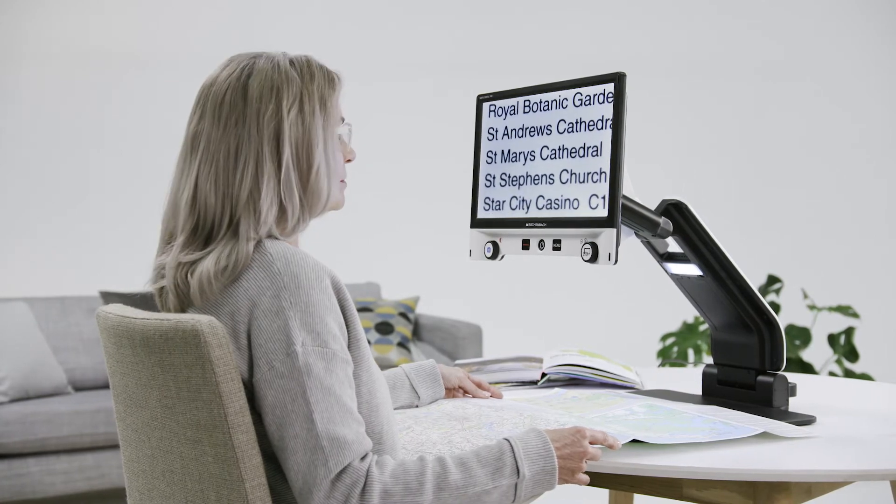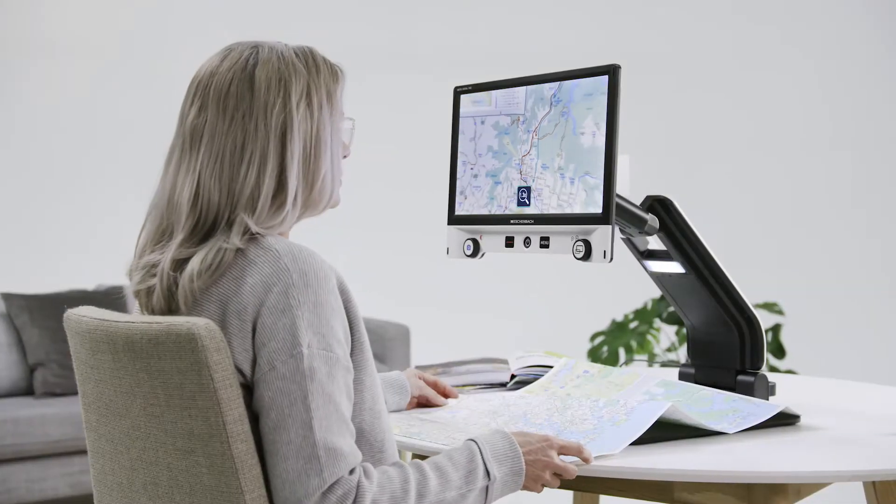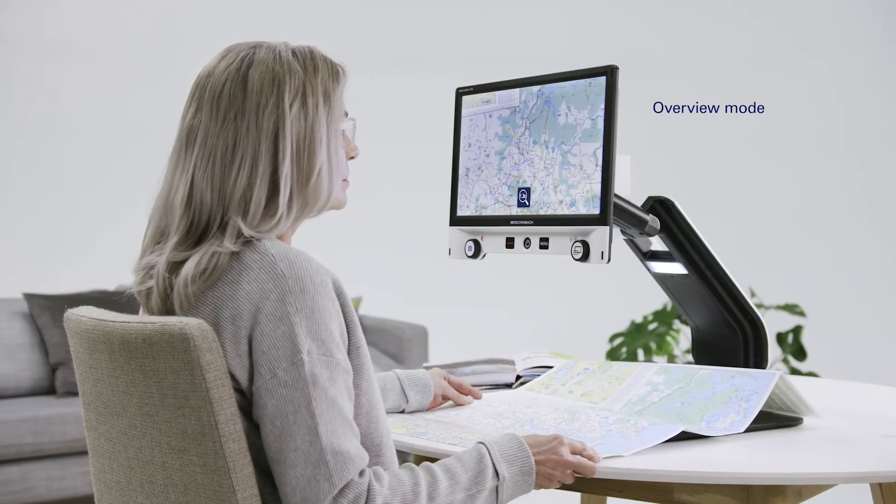A practical overview mode makes it easier for you to maintain orientation at all times, even in the case of high magnification levels. Just press a button to move temporarily to the smallest magnification level.